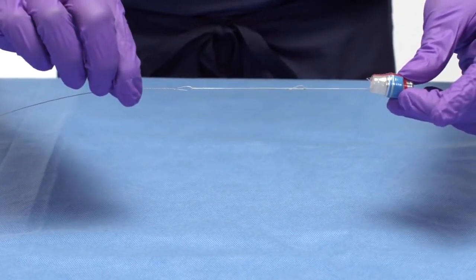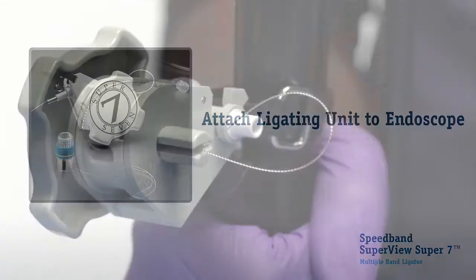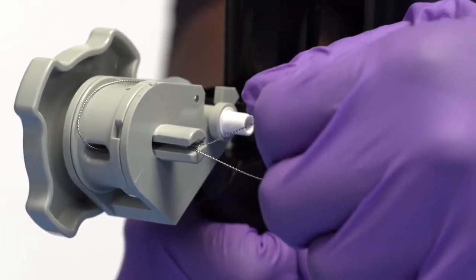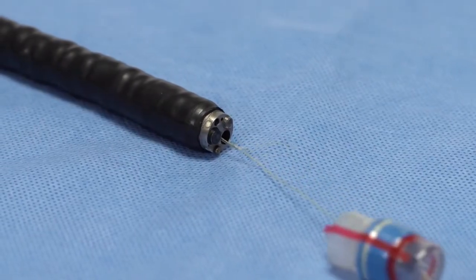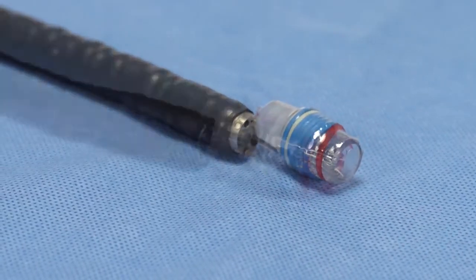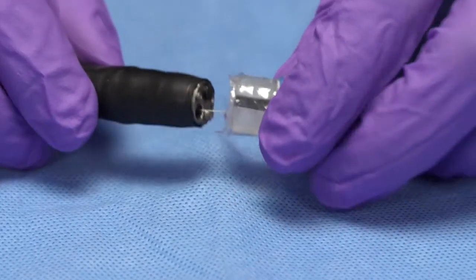Continue by attaching the ligating unit to the endoscope. Grasp the tripwire loop at the proximal end of the handle and retract until the ligating unit contacts the tip of the endoscope. Align the black stripe on the ligating unit with the working channel and push the ligating unit onto the endoscope.